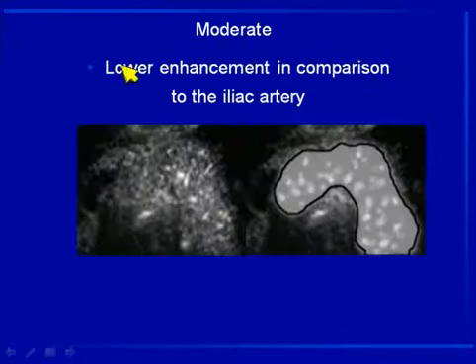Moderate enhancement, when you found lower enhancement of the pancreas graft in comparison to the iliac artery. An enlarged pancreas here with moderate enhancement and the iliac artery here. On the drawing is the same aspect of the left.